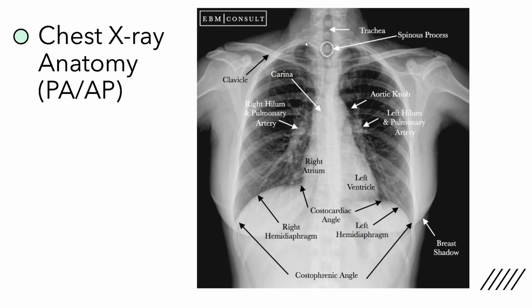On either side of the spine there you have pedicles. They're connecting the rest of the posterior aspect of the vertebra with the transverse processes. And then right in the center, that little circle there is the spinous process. So each vertebra will have pedicles on either side. They're kind of like eyes, and the spinous process is like the nose. You can think of transverse processes like the ears, like Dumbo ears.